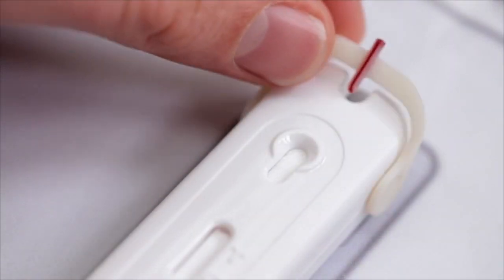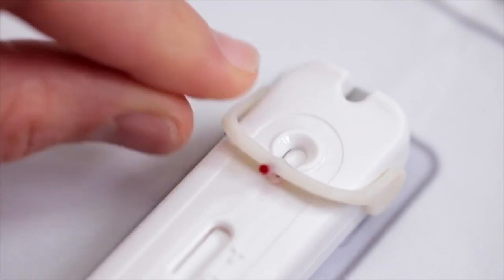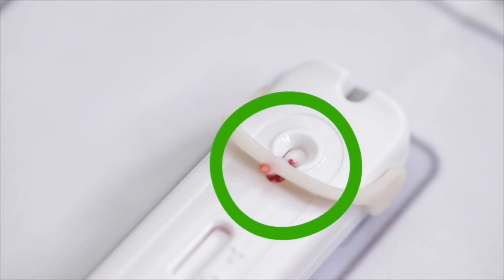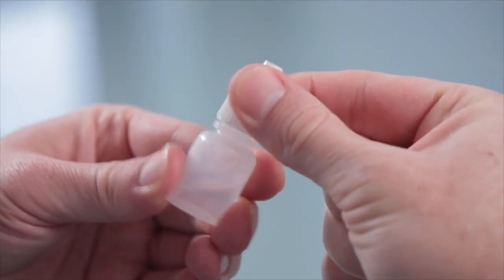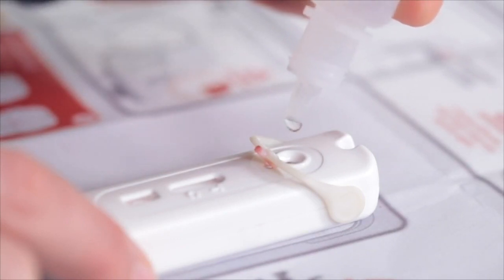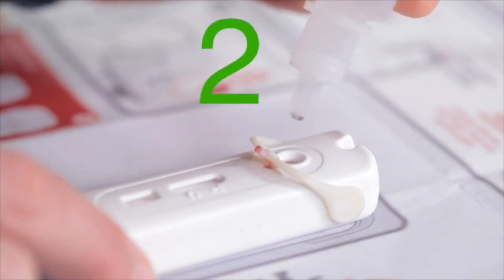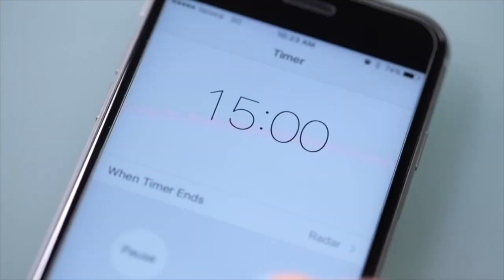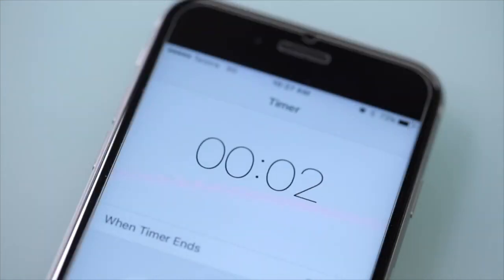Hold the test on the table and flip the tube over using its support arm until it stops. Check to make sure the blood has moved from the tube into the well. Now add 4 drops of test fluid into the well, on top of the blood. 1, 2, 3, 4. Set your timer and wait 15 minutes before reading the result. Reading the result before 15 minutes could give you a false result. However, do not wait longer than 20 minutes.